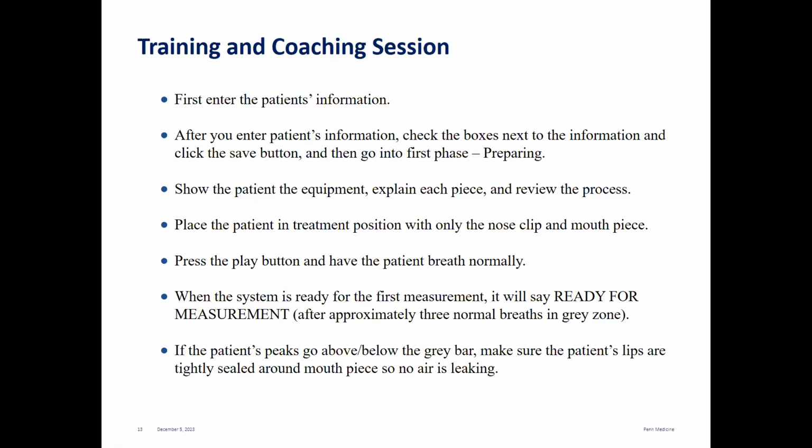You're going to place the patient in the treatment position with only the nose clip and the mouthpiece first, because first you just want to get their breathing. You're going to press play and have the patient breathe normally. When the system's ready for the first measurement, it will appear at the bottom, ready for measurement.